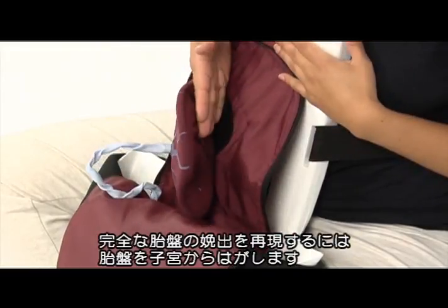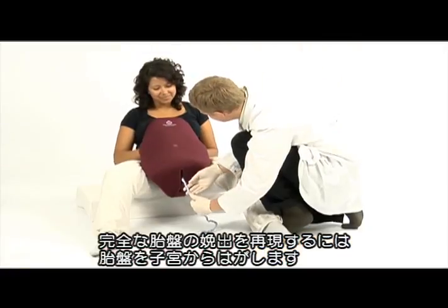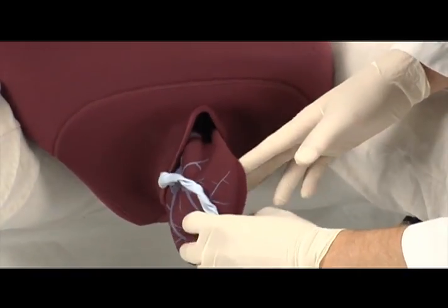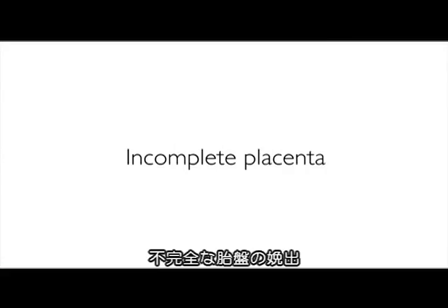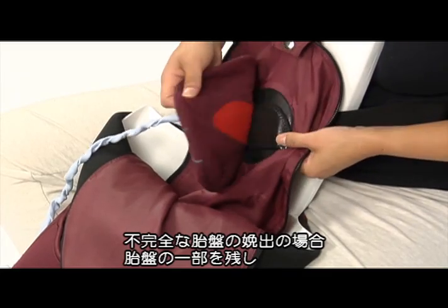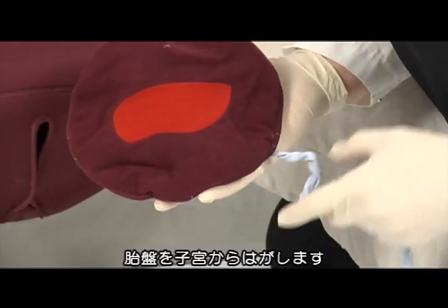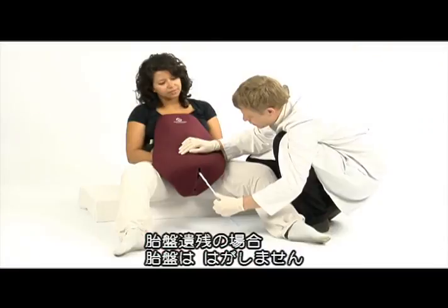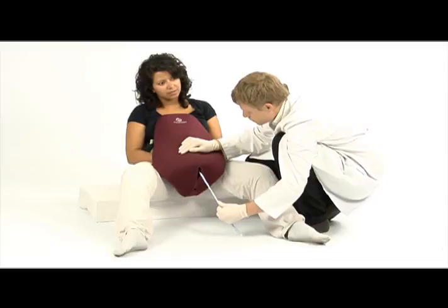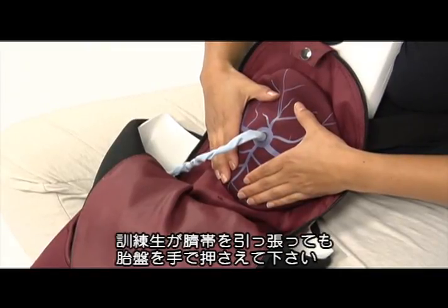For the delivery of the complete placenta, detach the complete placenta from the Velcro inside the uterus. For the delivery of incomplete placenta, detach the placenta from the Velcro inside the uterus but leave the small part attached inside the uterus. For retained placenta, do not detach the placenta. If the learner is pulling the cord, hold onto the placenta with your hands to ensure it stays in place.